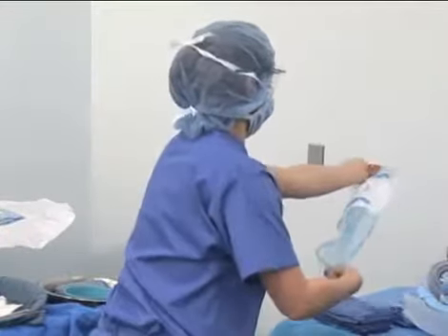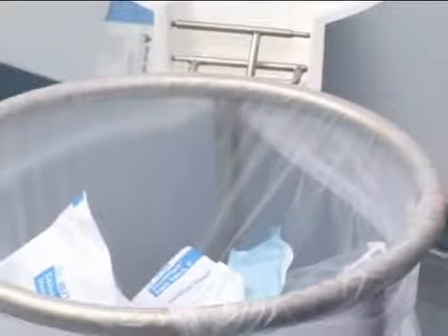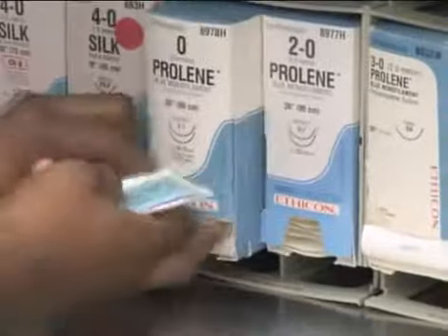While opening sterile supplies, place clean wrappers in clean trash receptacles. Do not use kick buckets or biohazard bags for clean waste. Extra sutures, special equipment, and implants should be held unopened until the surgeon asks for them. This prevents waste. Sharps are opened during the setup. The circulator opens the outer packages and the scrub technologist removes them and places them in a sharps holder.